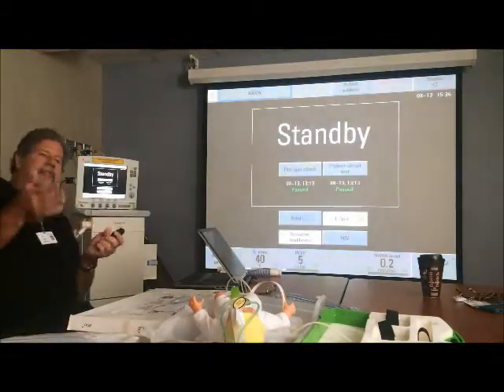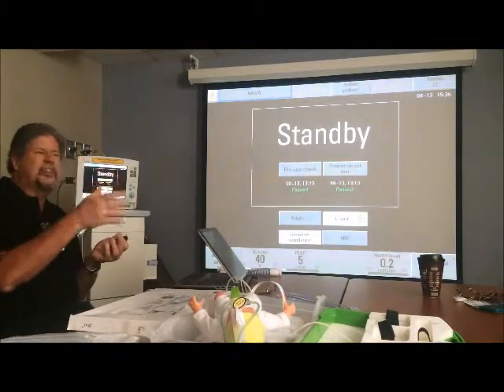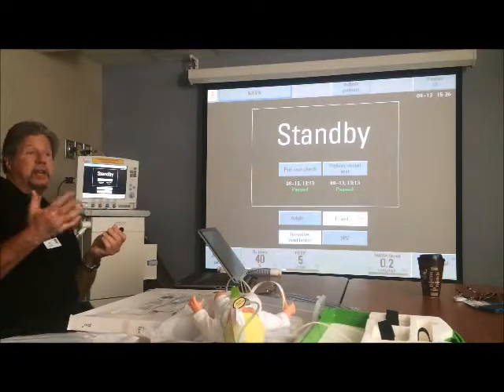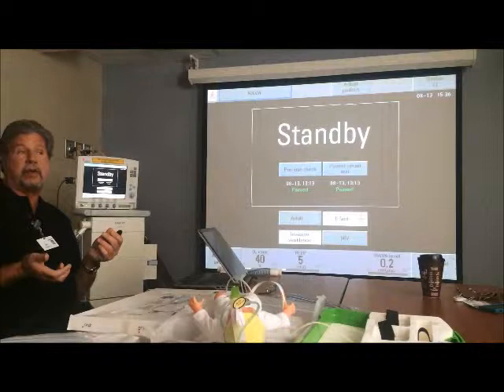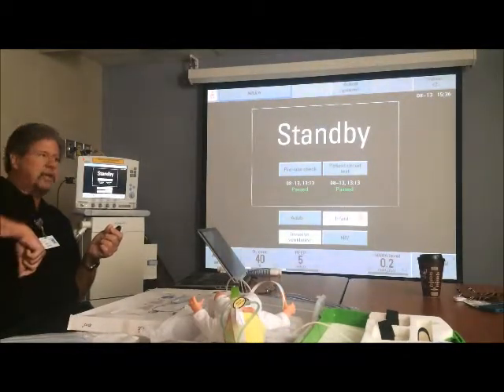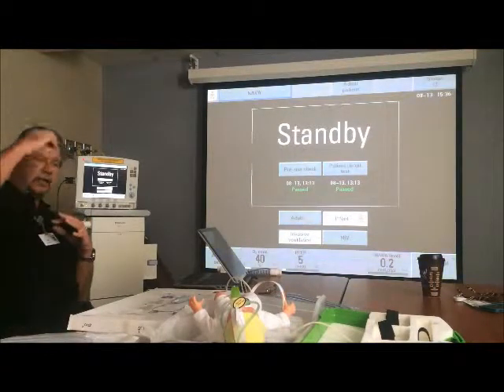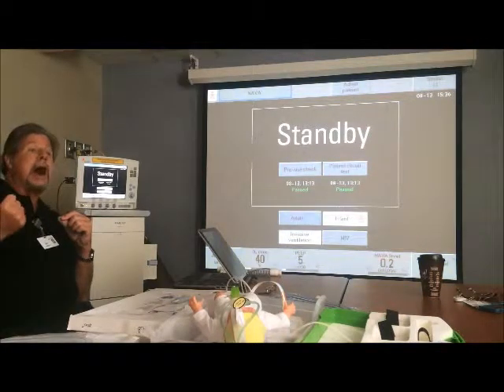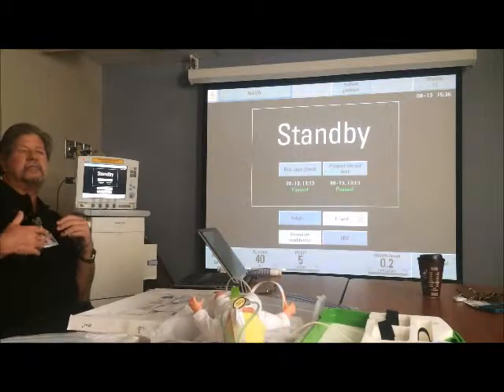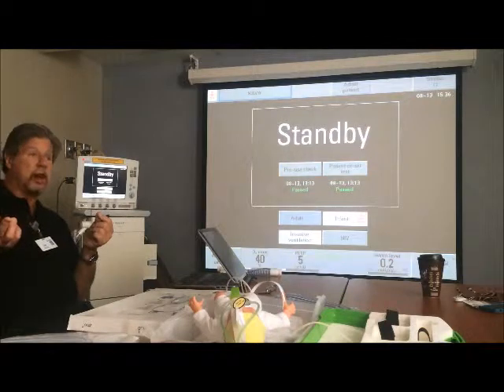understanding that when your NAVA level is at 0.2 or 0.3, you know, assuming a normal, relatively normal EDI, for example, in a COPD patient, an adult patient, if he's in respiratory failure, we've just intubated him and we're going to put him right on NAVA. We put the catheter in. We may note, because his diaphragm now, the electrical activity of the diaphragm had gone so high, but the diaphragm was not efficient, you might see an EDI of 70 or 80 or 90 or 100. I've seen babies with an EDI of 100.